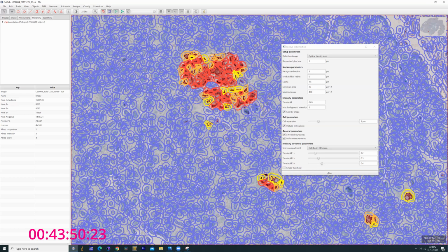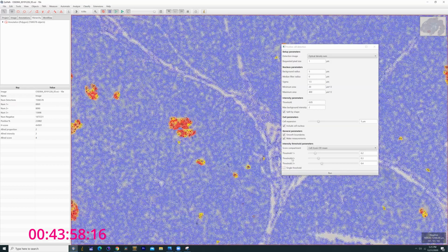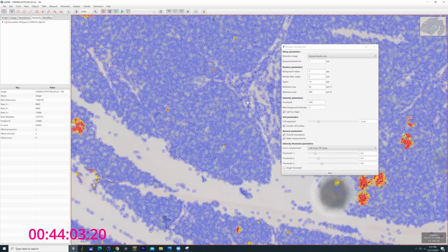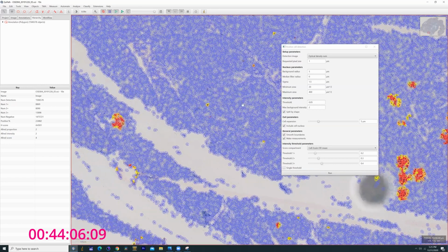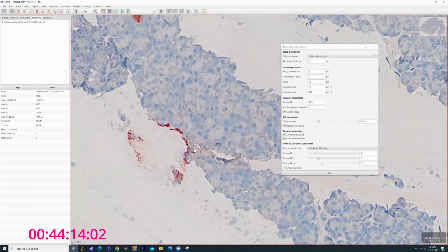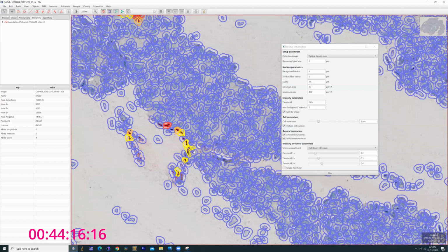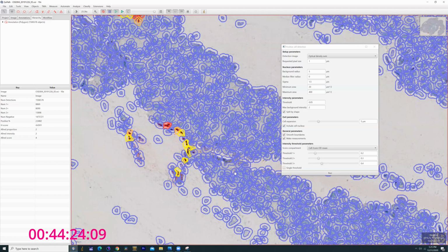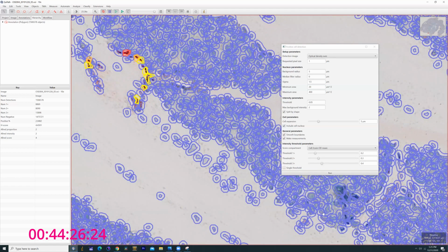Okay, I'm not mad with this. Now we have the prior color selection like we had before. And let me back out here for a second. Most of the open areas, the artifacts aren't being picked up. They're not really labeling. There is some staining here, which I think may be difficult to eliminate completely, other than through manipulation of this background parameter because of the nuclei. But I think the intensity is always going to be a problem because of the intense color.